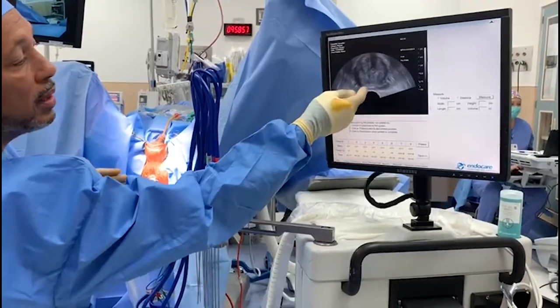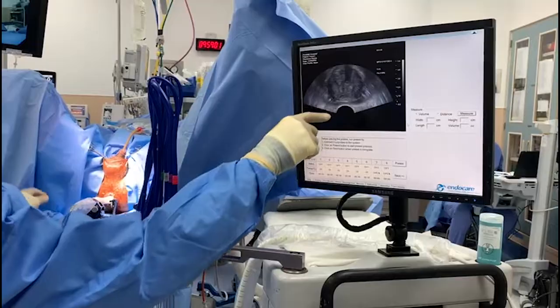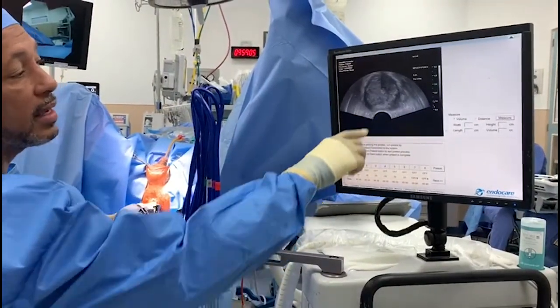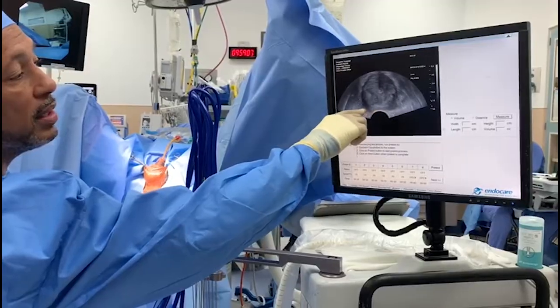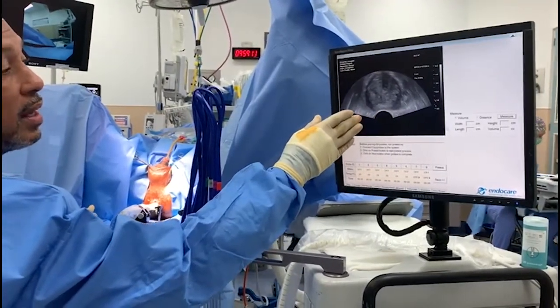Another super important thing is the separation of the rectum from the prostate itself. You can see this back plane in between here. I lift the prostate so that I can get a nice plane in between, so it doesn't come into play when we're actually doing the freeze-thaw cycles.